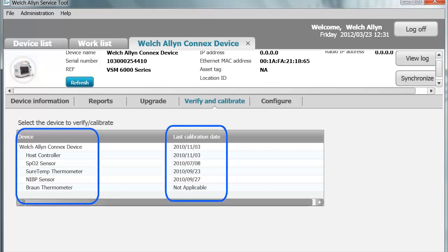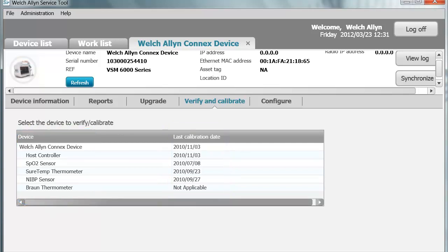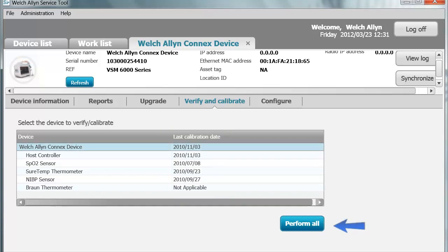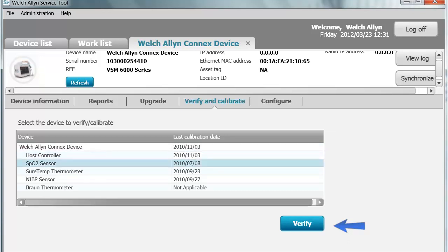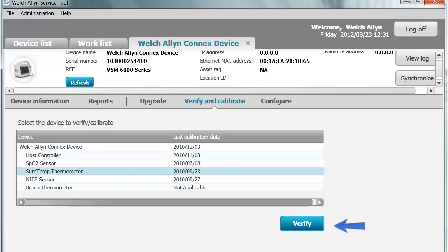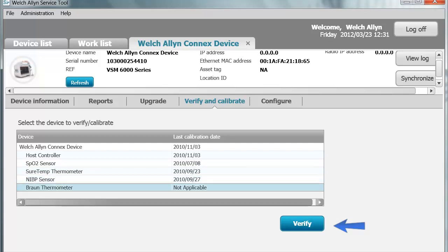On the Verify and Calibrate tab, you can see your device, all of its modules, and the last calibration date. The calibration date for the device can only change when you highlight and perform all — you must do a full calibration on the device in order to change this date. The reason is your device is only fully calibrated when you check all of its features. The SPO2 sensor and SureTemp Plus only require a verification. The NIBP sensor requires a calibration and the Braun thermometer a verification. The difference between calibration and verification is that with a calibration, if the device is found to be out of specification, it will write offsets to make corrections. Verification will not perform a calibration — if it is out of specification, you must replace that module.